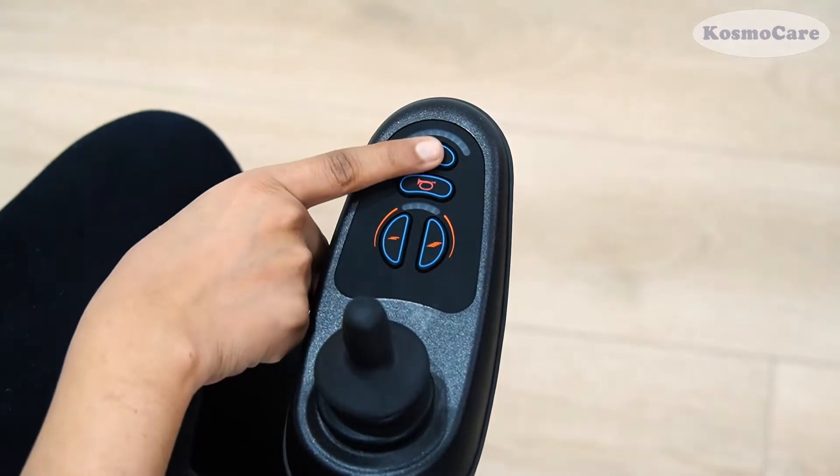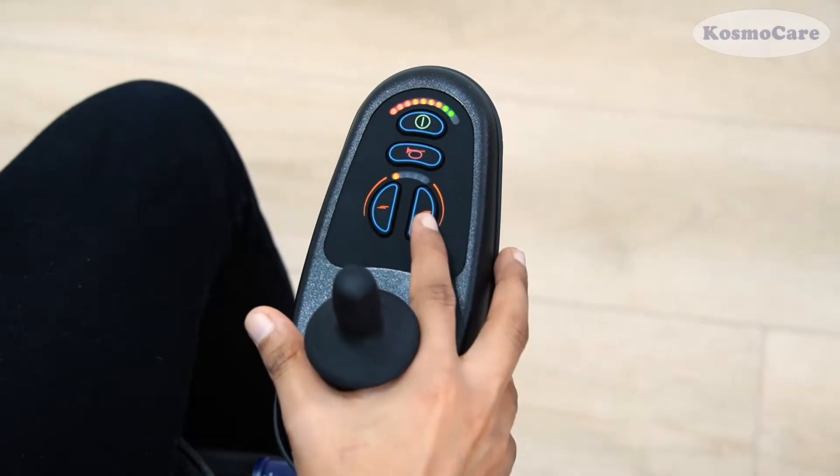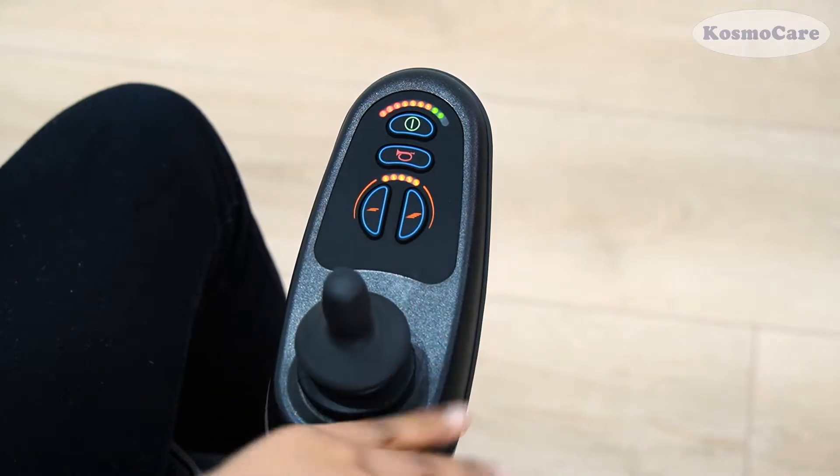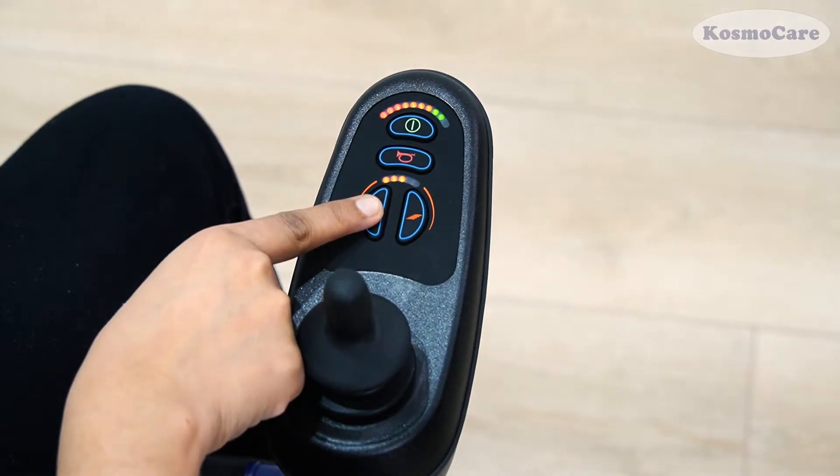Turn on the power switch button. The device will beep and indicate the battery level on the top and the speed level on the bottom. To increase or decrease the speed level, use the controls accordingly.